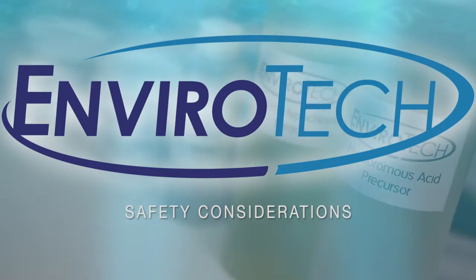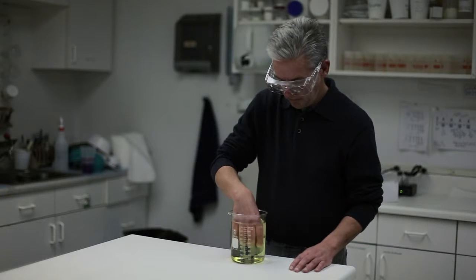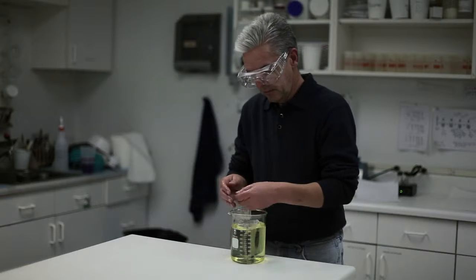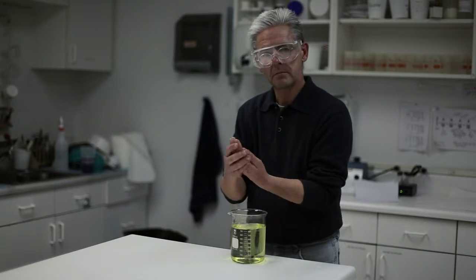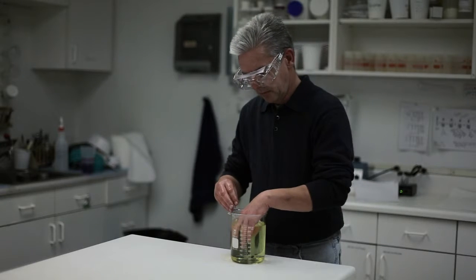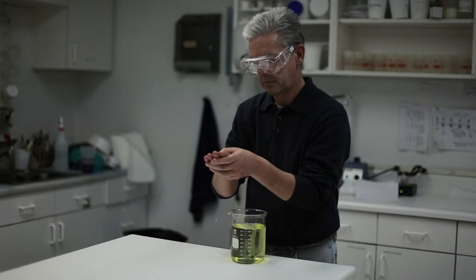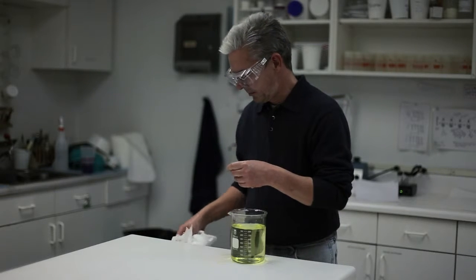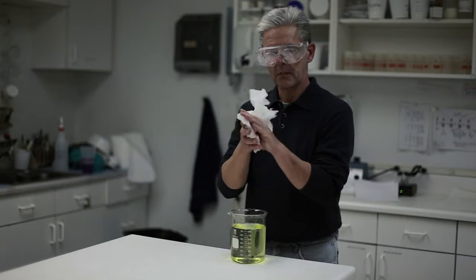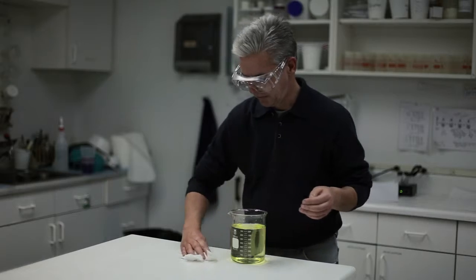Safety considerations. The activated solution of 3,000 parts per million of available bromine is pH neutral and quite safe to handle. I even use it as a hand sanitizer. Remember that this is the solution that will be diluted 10 to 13-fold prior to use. It does not dry or chafe the skin and leaves hands with a fresh smell that is unlike what happens when hands are exposed to sodium hypochlorite bleach.